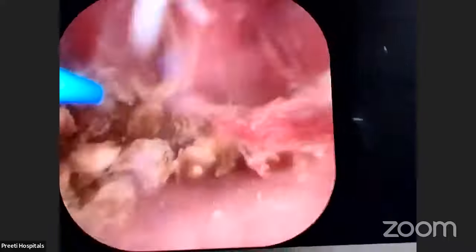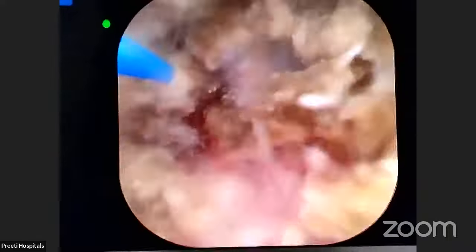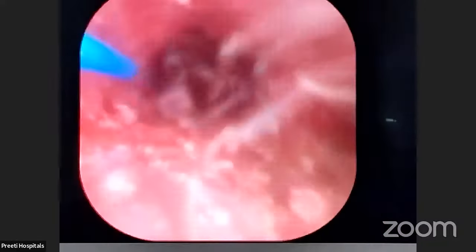Now again, I will go with the slightly increased frequency and popcorn, and at the moment I am in fragmentation mode. For large pieces, fragmentation mode is better. For very small pieces only, popcorn. Now you increase the frequency to 15. In this, only a little frequency increase. Suck it out. Ramakrishna, flush and suck it out.